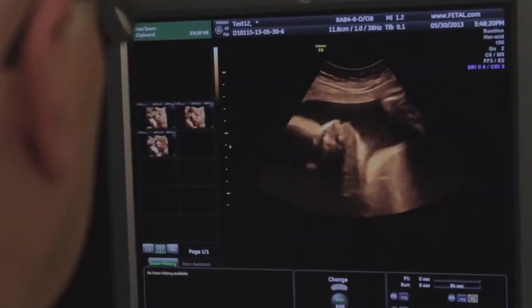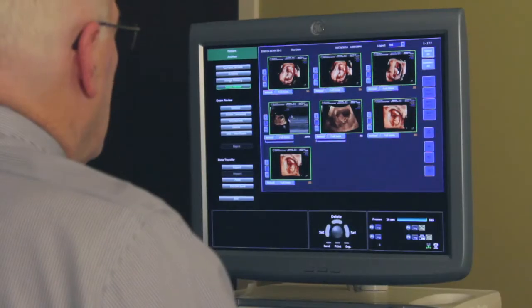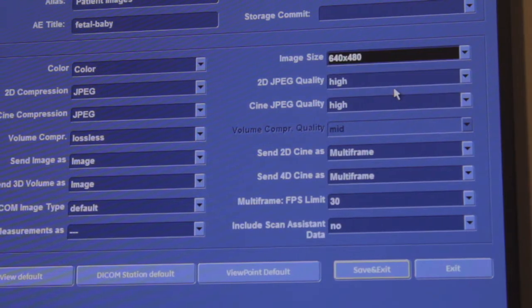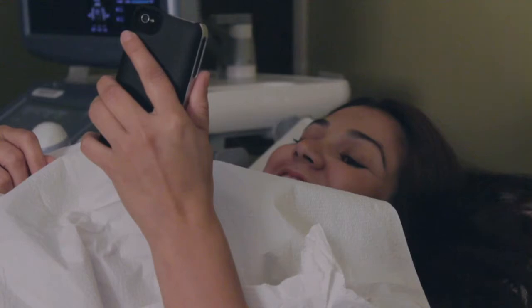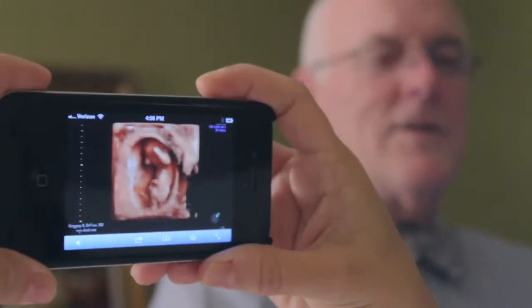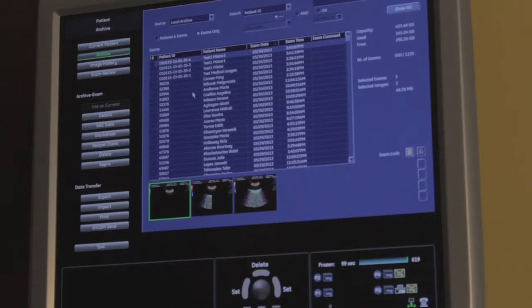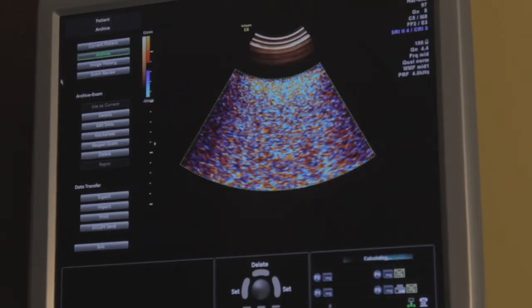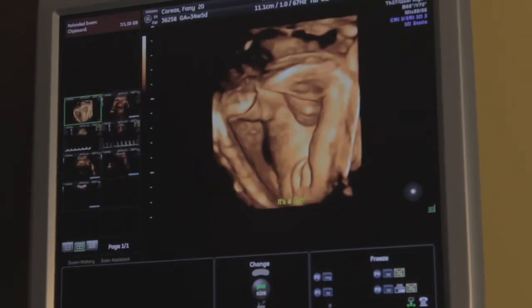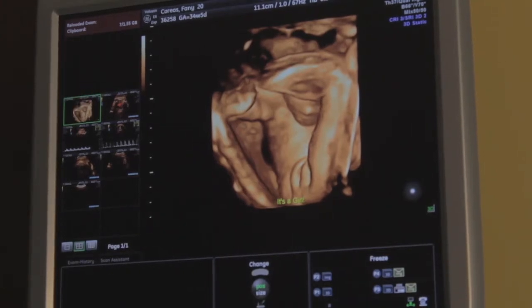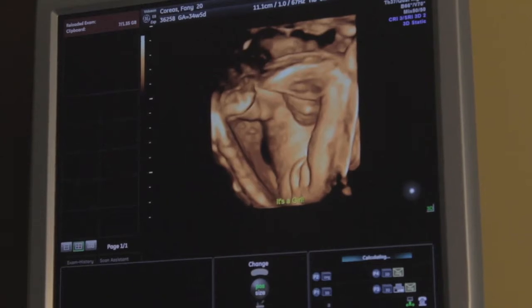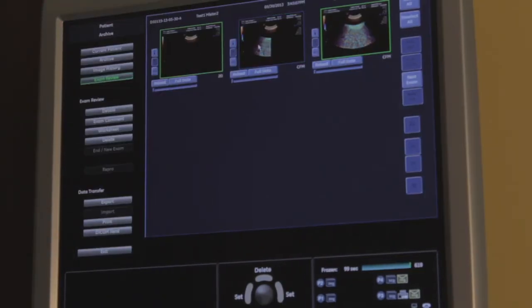On machines with configurable P buttons, studies may be sent directly to patients from the ultrasound system during an exam and without logging into the interface. On machines without configurable P buttons, images can be sent after an exam directly from the ultrasound machine by navigating to the archive or review screen, selecting the images and clips to be sent, then sending them to the proper DICOM store or destination.